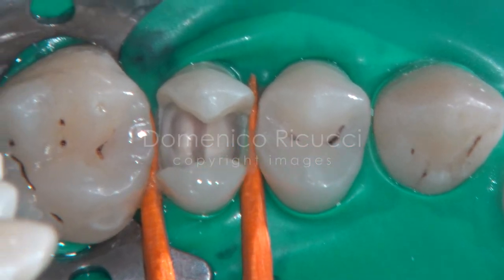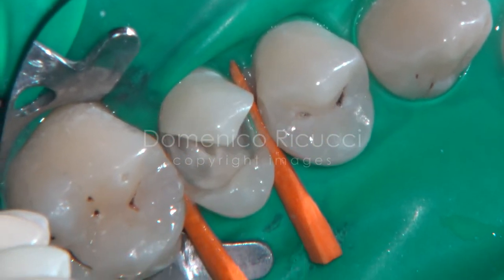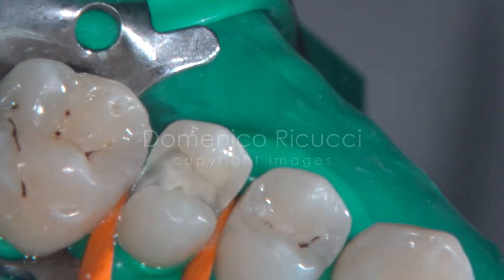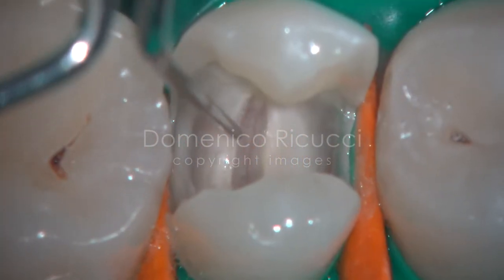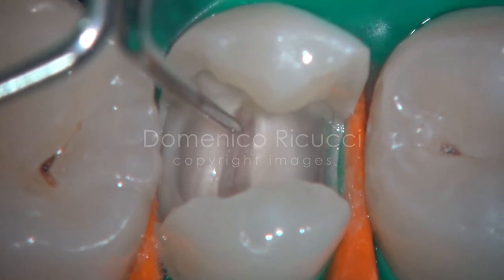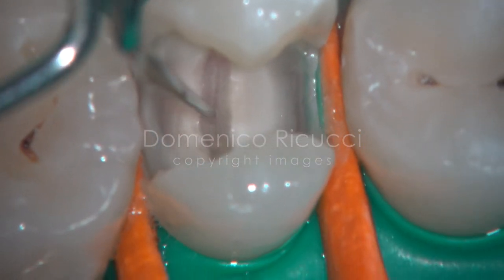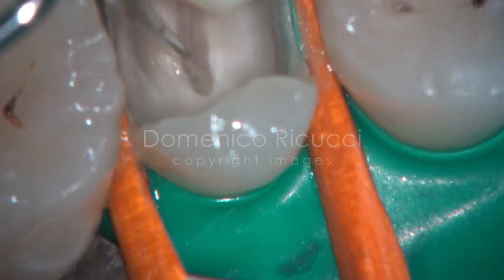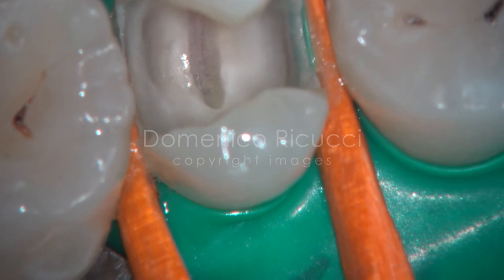Excavation is now completed. Only clinically sound dentin is left over the cavity floor. Note that, adjacent to the pulp chamber, excavation is terminated on the tertiary dentin, which can be recognized by its different color. This tissue, more sclerotic and less tubular, was produced in response to the carious attack over time.